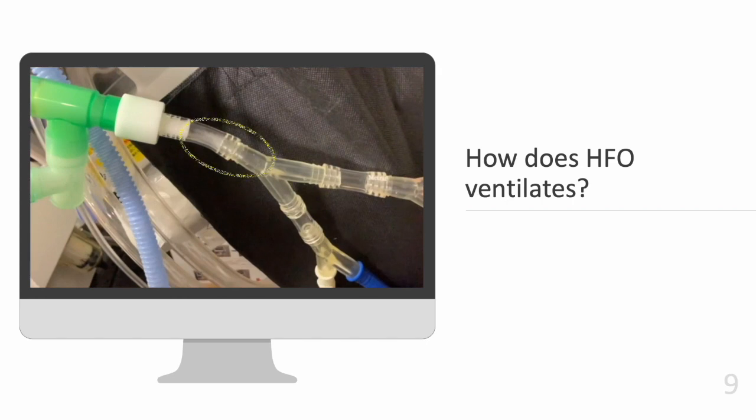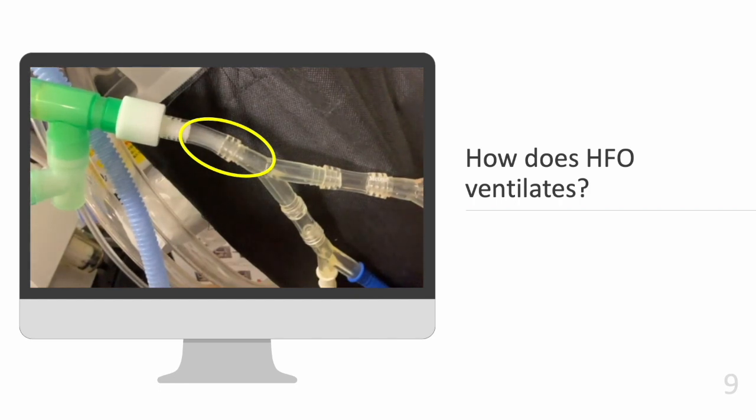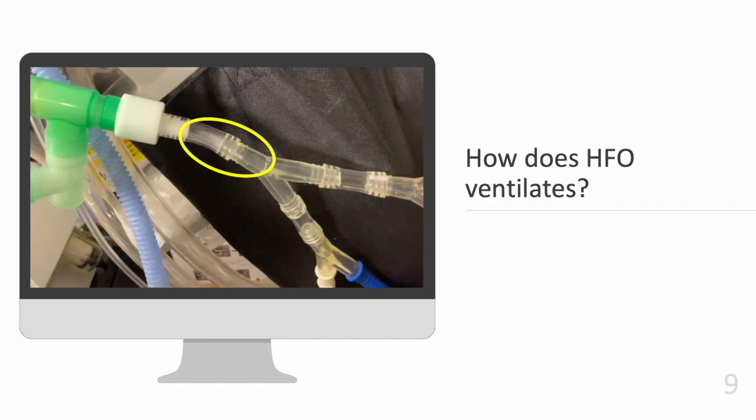This video shows the actual ventilation with HFO by filling the ventilator circuit with smoke. The smoke can be observed moving back and forth due to the change in pressure caused by HFO. Even with a small amount of tidal volume, we could observe by the smoke movement that ventilation is possible by using high-frequency movement. But it is still a matter of wonder why artificial ventilation is possible with this method.